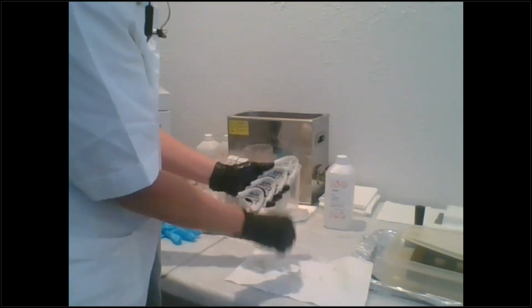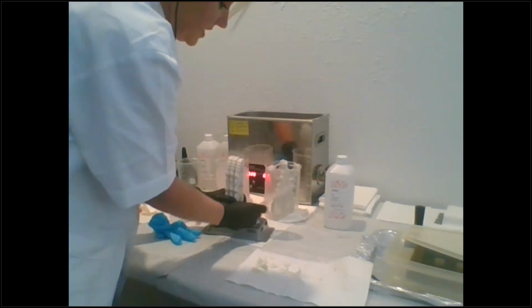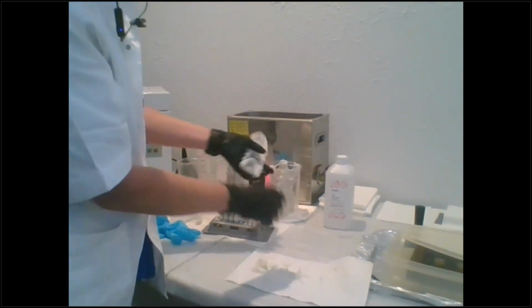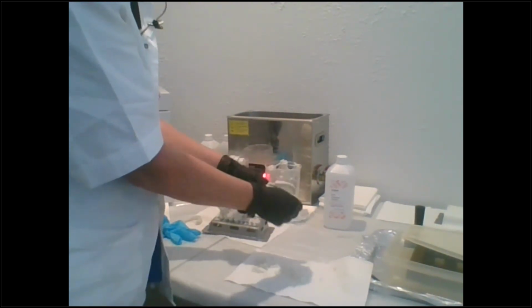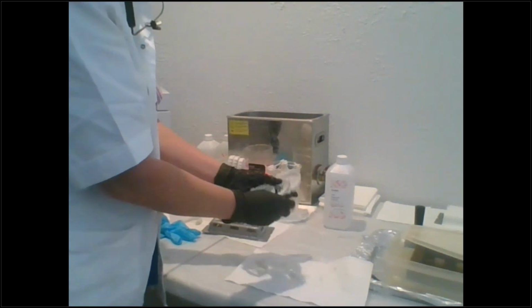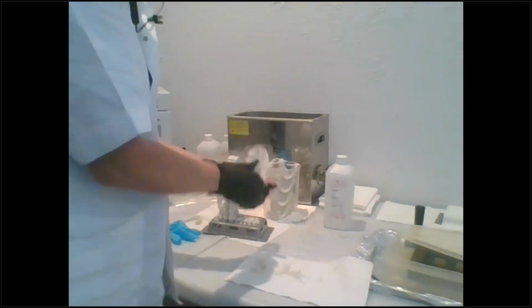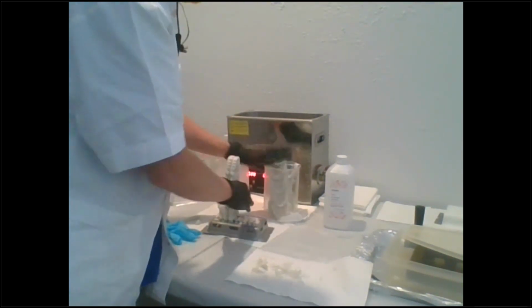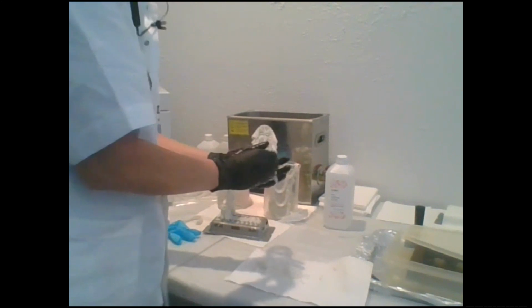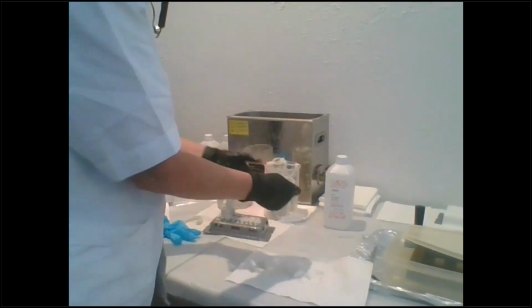So peel off your lingual supports, put them all in. And look, guys, if you have a small ultrasonic and you don't have room to even put them in a full stack, you can just break apart the stacks right now and put them all in like you saw me do with the single level, okay? So this one is 40 models in the stack. And so you can see that it really doesn't take much time to pull these little lingual supports off of there.